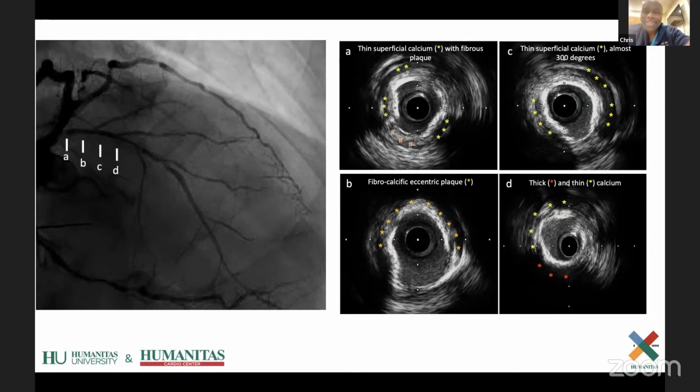Okay. Yeah, it looked like a very circumferential lesion and quite long too. Yes. So if we adopt the same strategy as before, maybe rotablation could be a nice strategy for the first run. What do you think, Antonio?